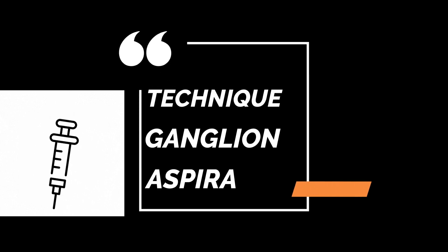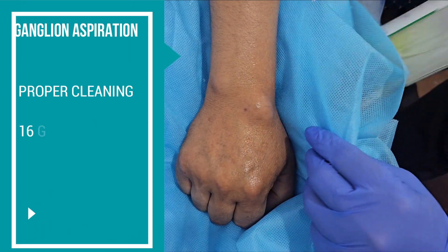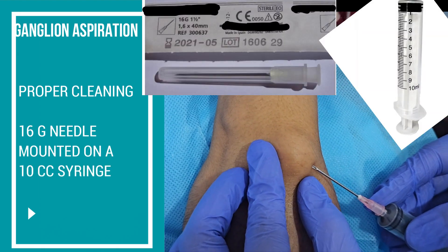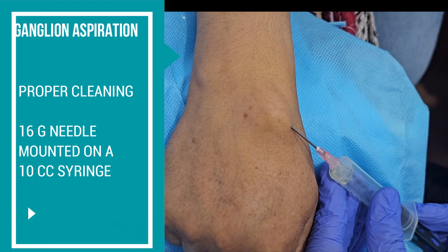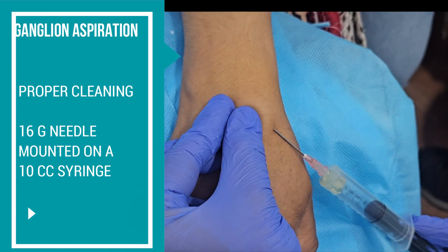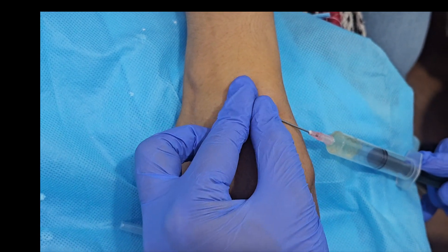Now I shall demonstrate the aspiration technique for a ganglion cyst. First, we thoroughly clean the area by spraying antiseptic solution over the ganglion site. For the aspiration we require a 16-gauge needle mounted on a 10 cc syringe. Once the syringe is introduced, it is slowly aspirated, and as you can see the contents of the ganglion are slowly coming into the syringe. It is a thick viscous gel that is being aspirated.